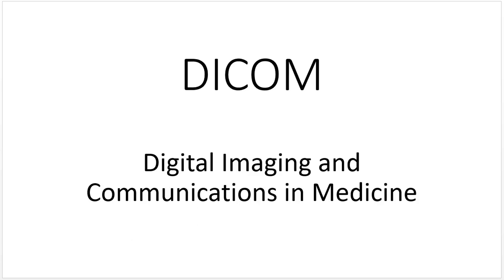Hey everyone, I want to go over some of the DICOM terms and review them and reinforce the concepts behind these terms. DICOM stands for Digital Imaging and Communications in Medicine, and communication is the key word here. DICOM is not just a file type like JPEG or bitmap. It involves communication. There's a whole network protocol for how two DICOM entities talk to each other. That's why DICOM is more than just a file type.